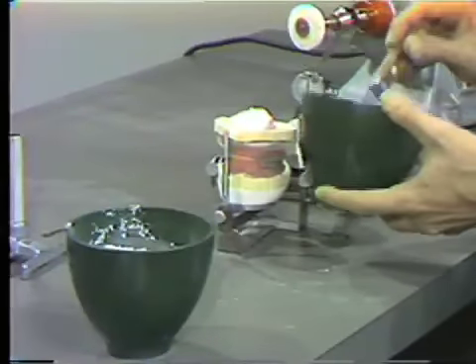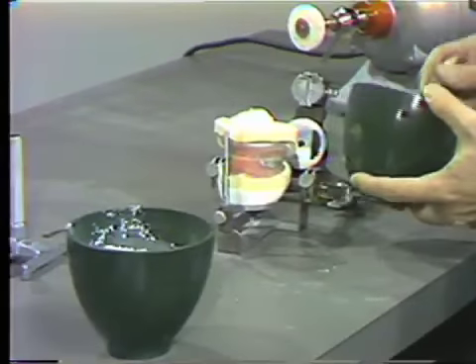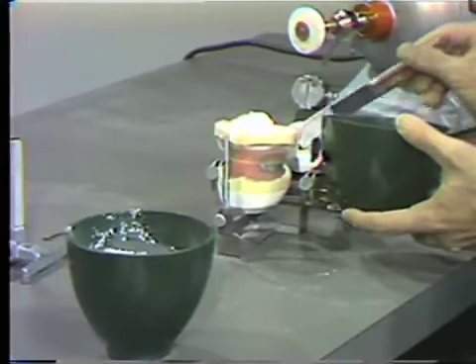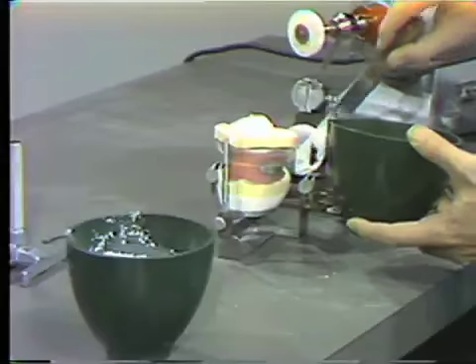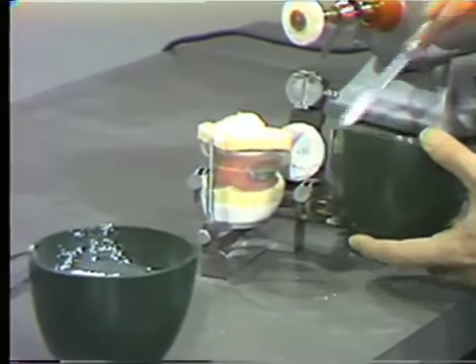All right, that probably is enough for there. Now we'll place some plaster on our mounting rings just to lock those accurately into place.